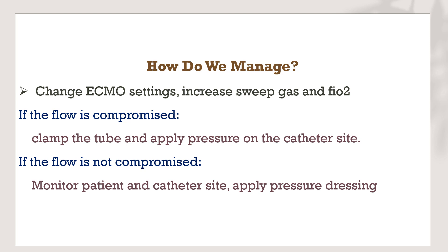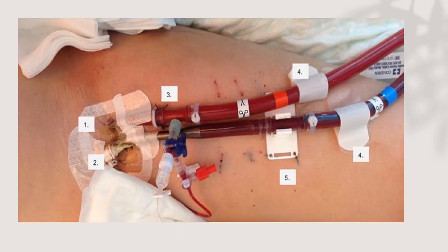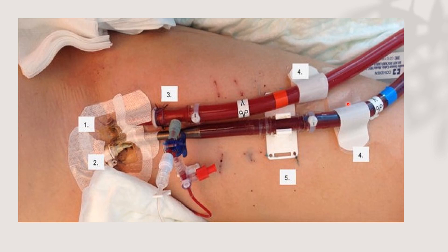This picture shows proper dressing technique over the ECMO cannula: the dressing should be transparent, secured with multiple suture fixations, with fixation points on the cannula from below and multiple sites to secure the cannula — preventing any movement, dislocation, or decannulation when the patient moves their limbs.